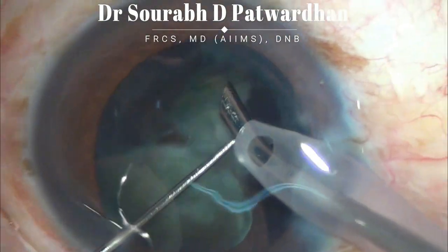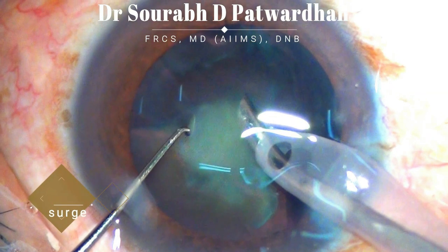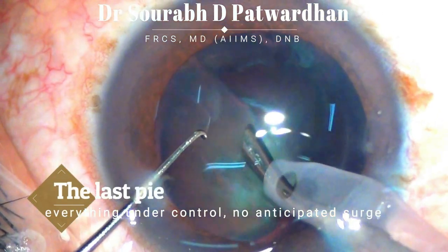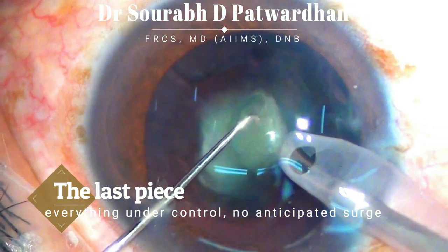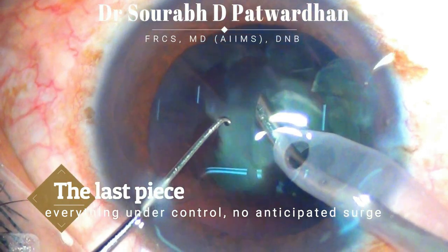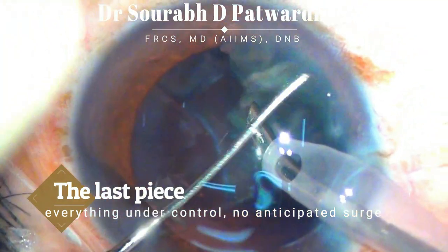When you are emulsifying one piece, drag the other piece to one side so it keeps protecting the posterior capsule. As you keep watch on the fluidics and everything is under control with no anticipated surge, you can emulsify the last piece comfortably, keeping the FACO tip right at the center in the safe zone and ensuring that there is no surge happening when you are emulsifying the previous pieces.